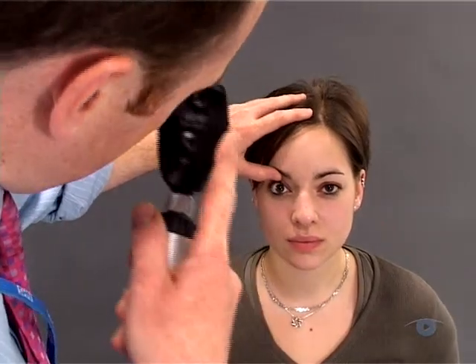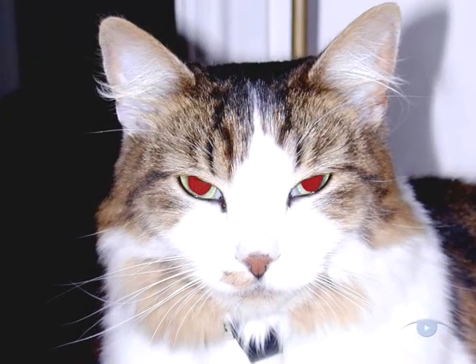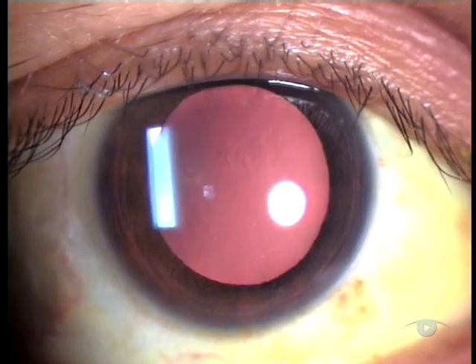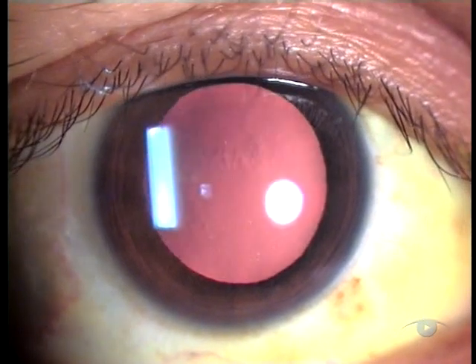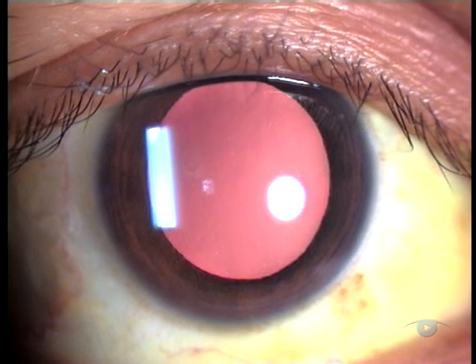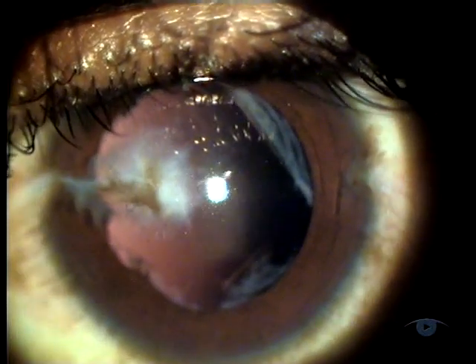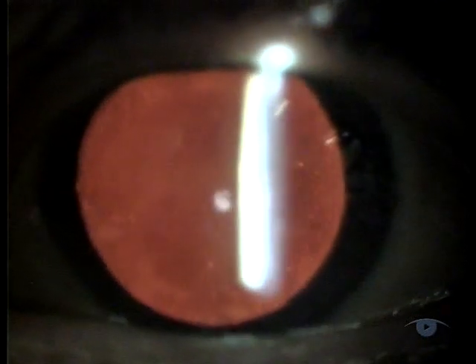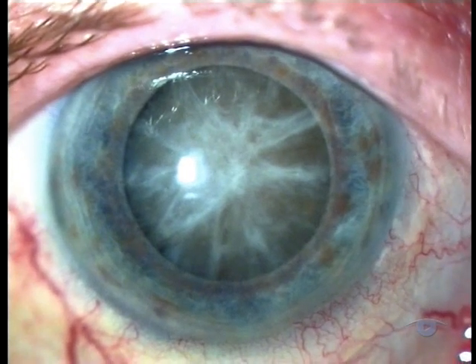Now shine the light into the pupil and observe the red reflex. The red reflex is the same phenomenon as the red eye seen in flash photos — it's simply the reflection of the ophthalmoscope light back off the choroidal vessels. It's very useful for assessing the clarity of the ocular media. Any opacities such as a corneal scar, a cataract, or a vitreous haemorrhage are backlit by the red reflex and silhouetted in the pupil. If the opacity is particularly dense, then the red reflex will be abolished altogether.